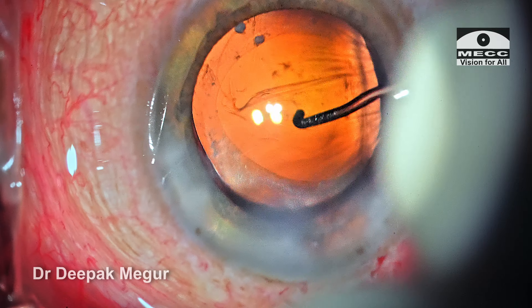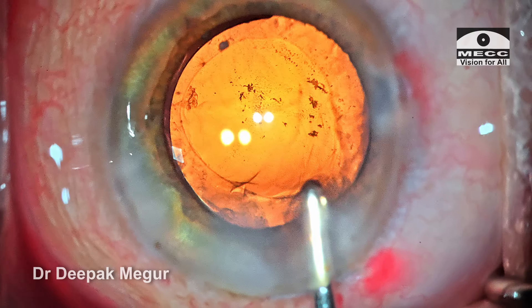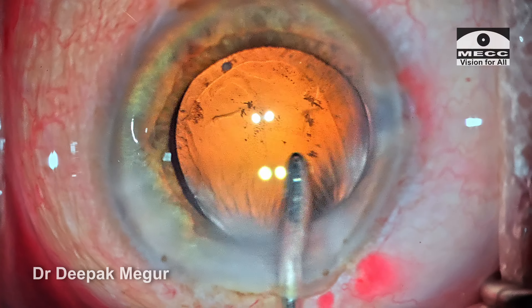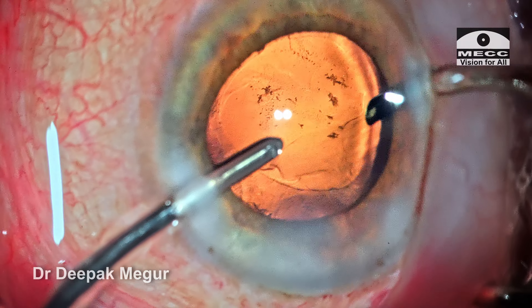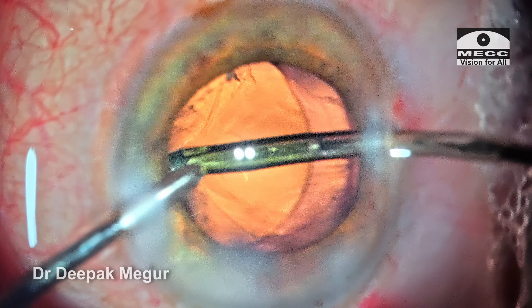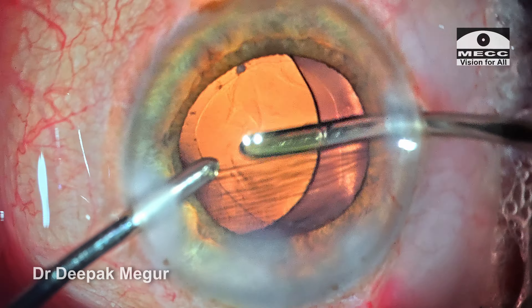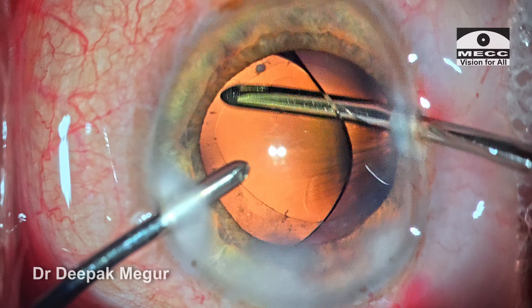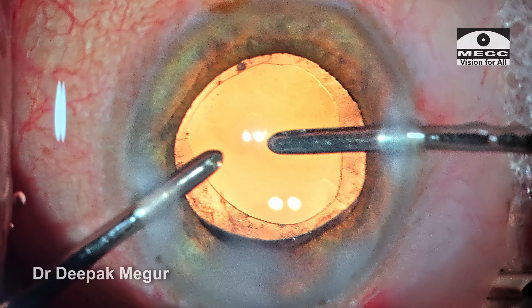A common question asked is how to remove the OVD. My preference is to go in with just the irrigation cannula first, then go through the main incision and depress the main wound so that the OVD in the anterior chamber flows out easily. Then use one of the side ports to go under the lens, lift up the lens, and irrigate — you don't have to use the aspiration port behind the lens. The aspiration port is held anteriorly in the anterior chamber while the irrigation is in the bag behind the lens, and in a couple of minutes the entire OVD is flushed out and the bag is totally devoid of OVD. This is a very quick and safe way to remove OVD.